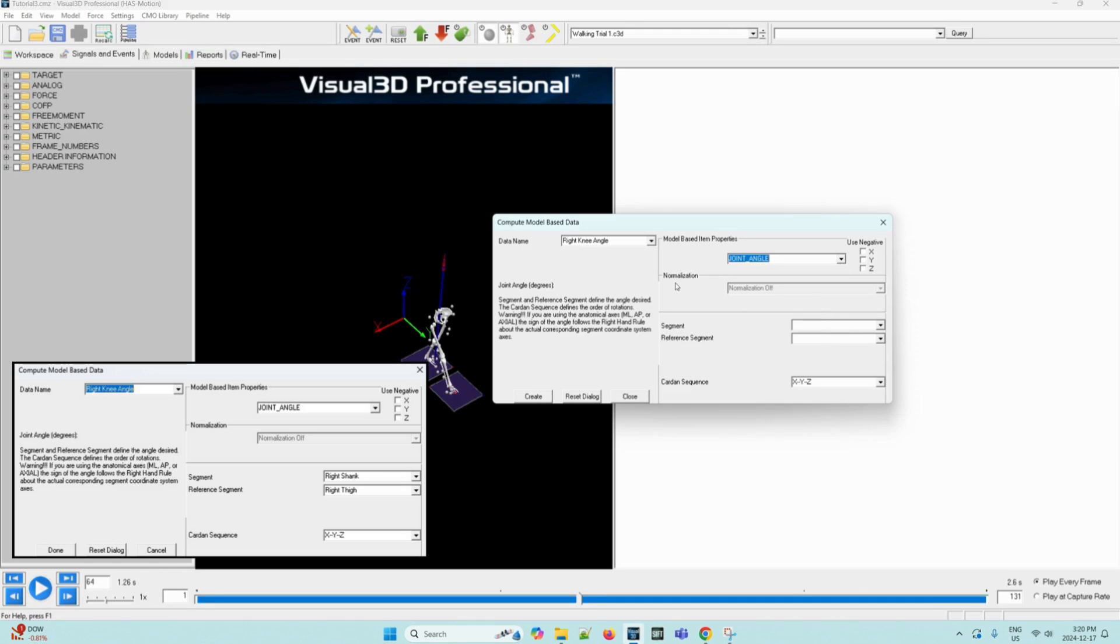As we can see, the default normalization is off. And then the segment will be the right shank. So we can select it from the drop down, right shank. And the reference segment will be the right thigh. This will also be at the drop down. And we can select right thigh. The Cardan sequence XYZ is automatically selected for us. And this is the equivalent of the joint coordinate system. Now we can press the Create button.